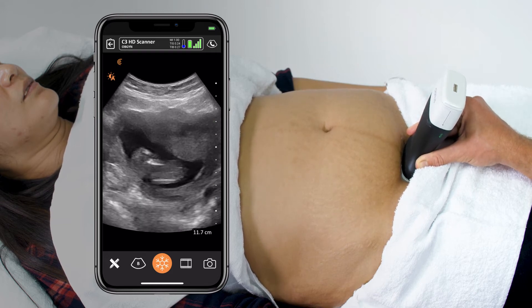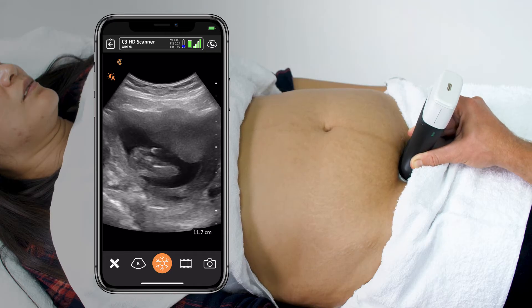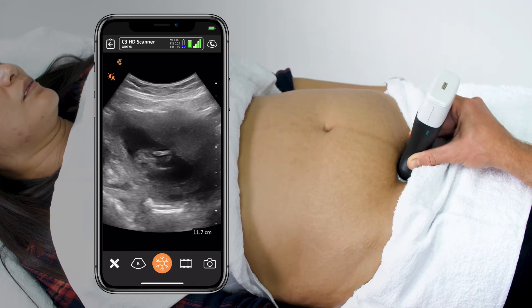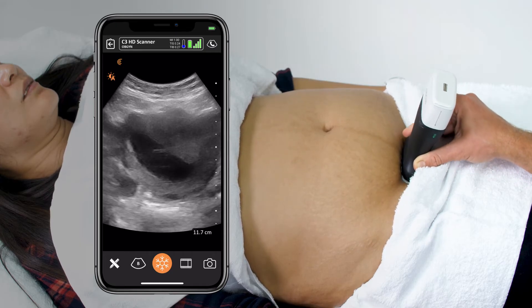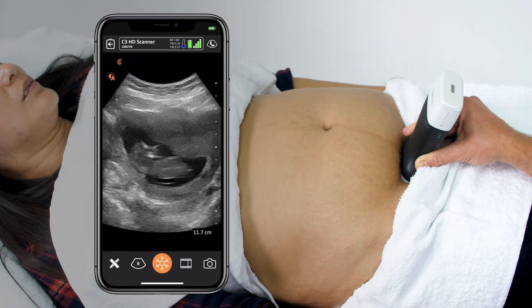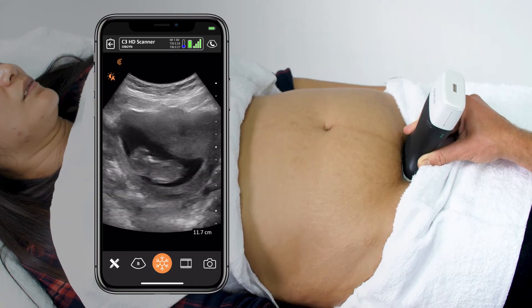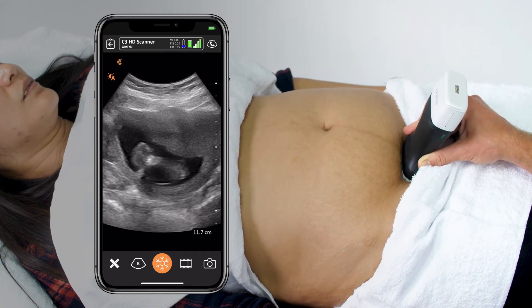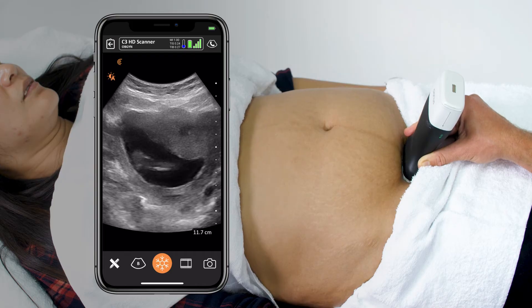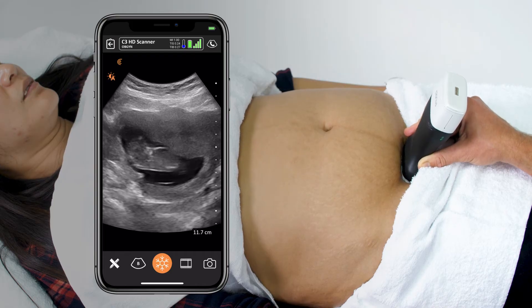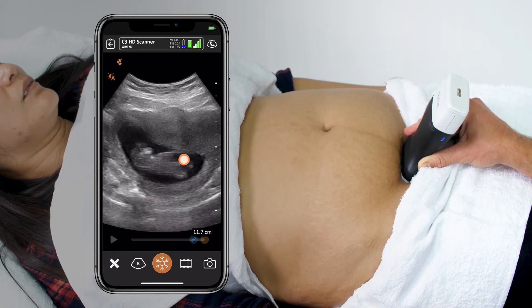The easiest measurement for first trimester gestational age is the crown rump length. Some maneuvering is required to really get the maximal crown rump distance, so I'll fan around and rotate until I feel confident that I've identified that.